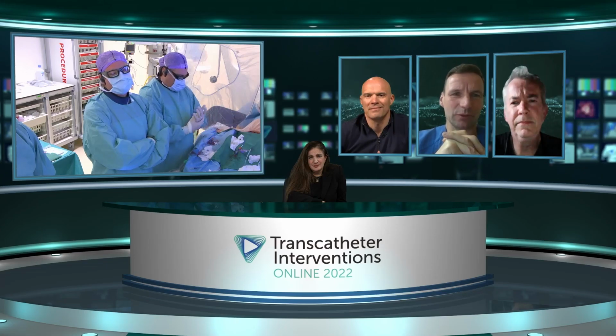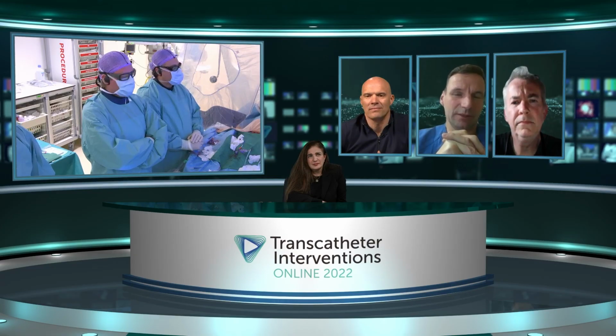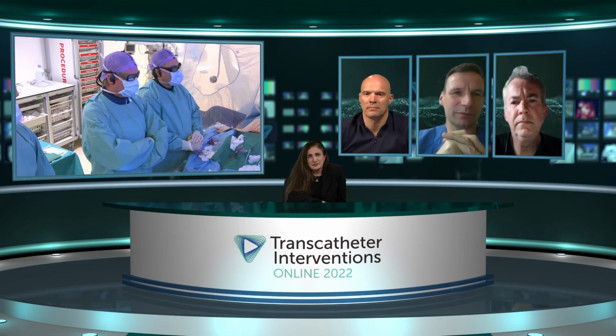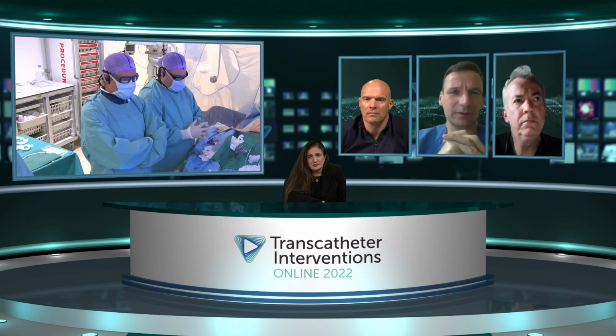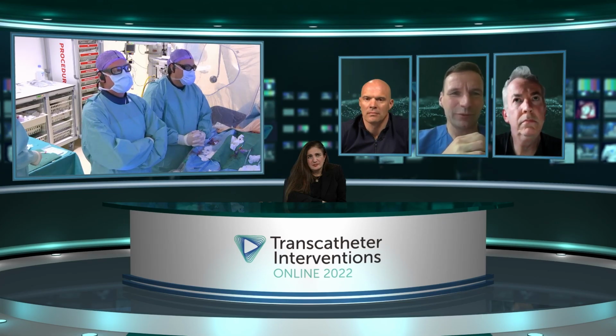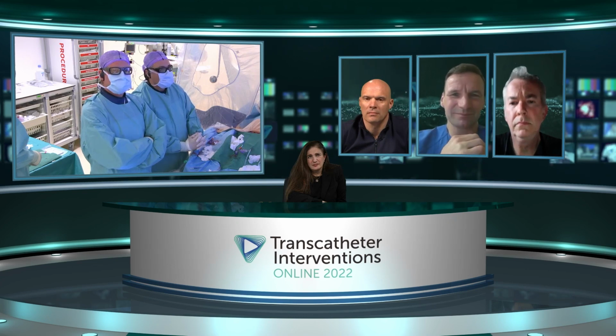Holger, what would be your approach? Yeah, difficult case, so interesting case. I'm looking forward to how they really want to manage it. So at least I would be prepared also to go for retrograde. As a second step, try to do it antegradely, but for sure, I think in the end, it may be necessary to go retrograde. I've been looking at the septal collaterals. They look nice, so it should be possible.